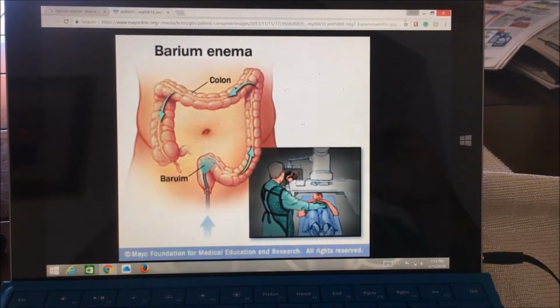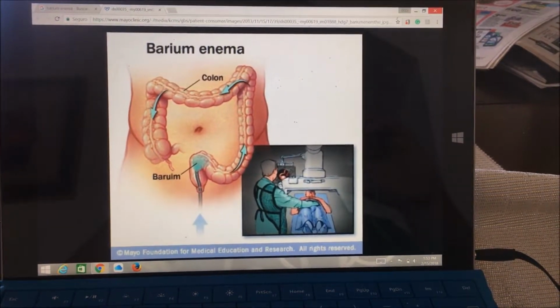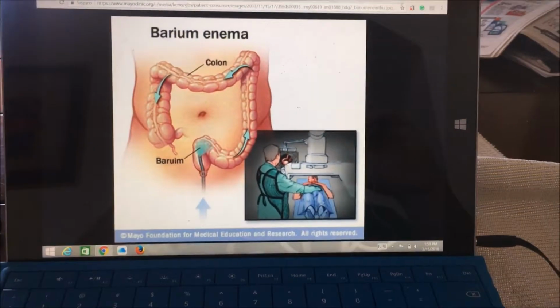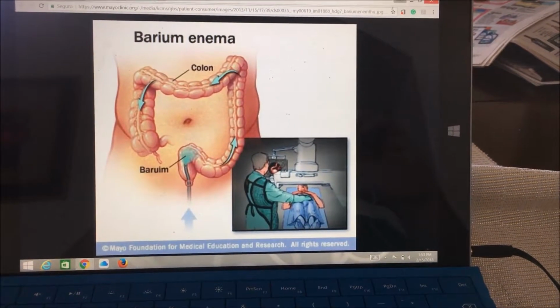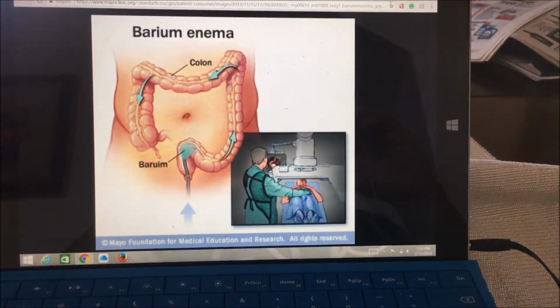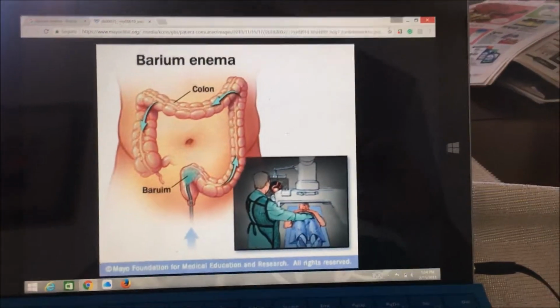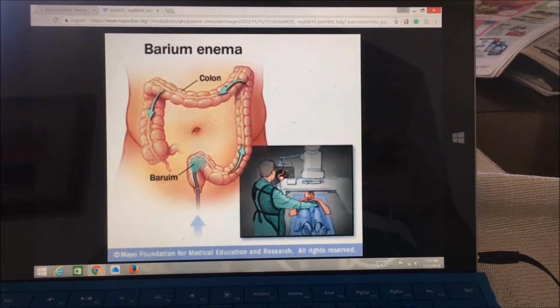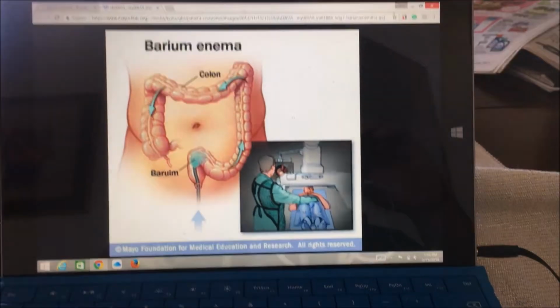When doing a barium enema, you always have to consider the patient chart and discuss that with the radiologist. Never force the enema tip in the patient's rectum. The height of the enema bag should not exceed 24 inches or 2 feet from the table. The water temperature should be warm, not too hot and not too cold. And when you get to the post evac, you have to assist the patient to the restroom as quick as you can.